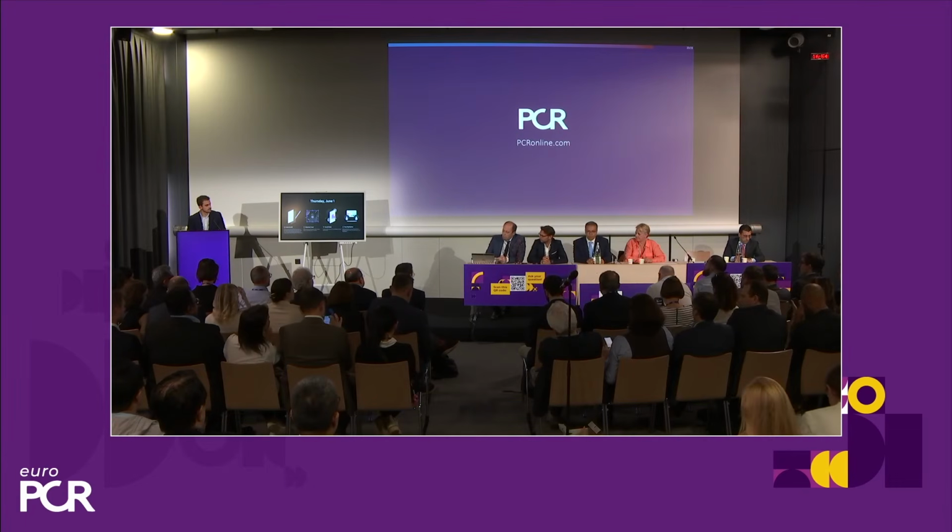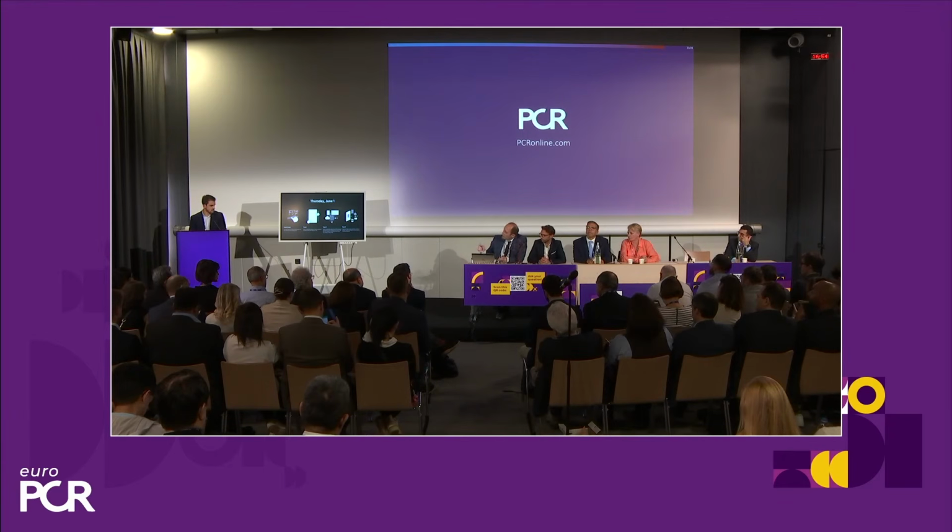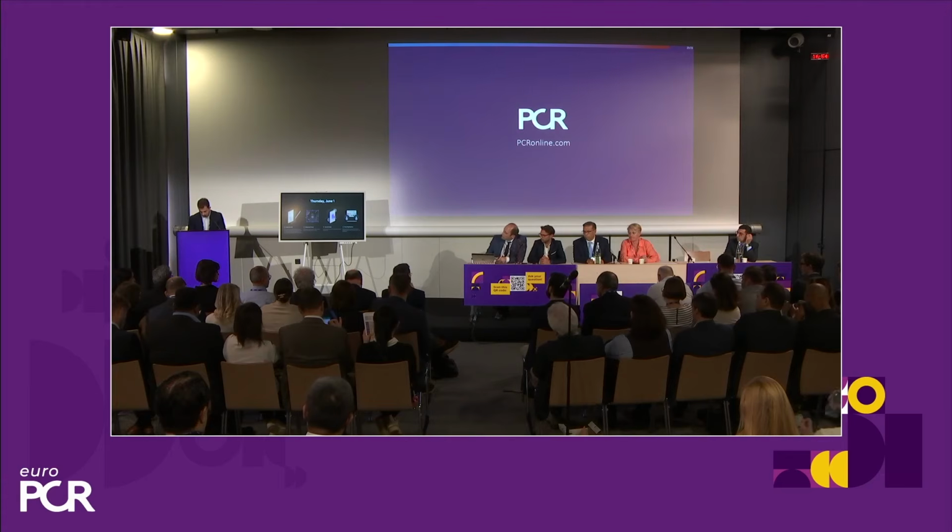I have some questions from the audience for you. In particular, I believe the audience appreciated your slide with the integration of angio-FFR, angio-IMR in comparison with FFR. The question is, if you have a borderline value of FFR, so 0.82, 0.83, your suggestion is to reassess the vessel with QFR and angio-IMR, trying to understand if it is a patient with a false positive. So can you explain better this important topic and how you can imagine in the future the integration of epicardial and microvascular assessment? Thank you.